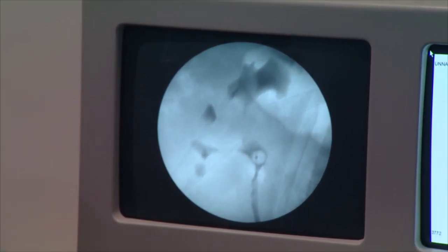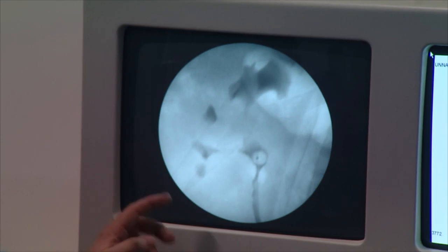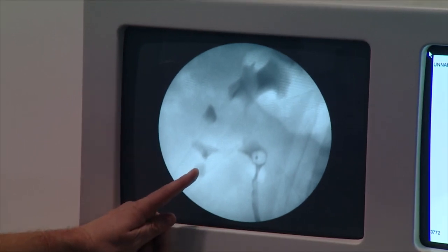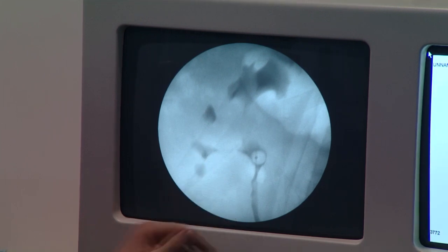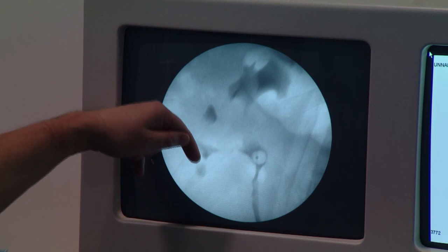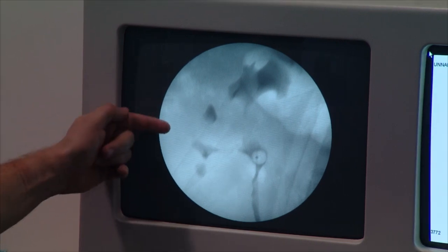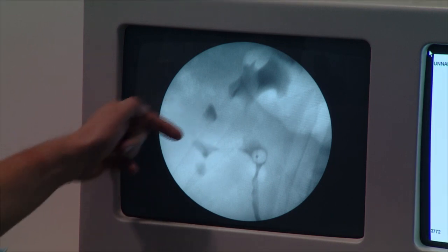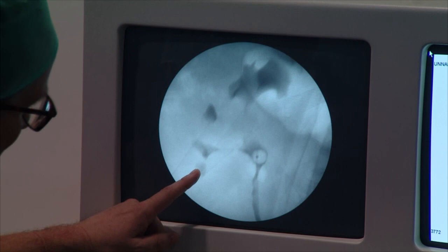You will do the puncture of the other calyx through the septum between the calyces? My suggestion is to do a puncture like this, and to approach the stone this way. But I do not prefer to do a puncture like this and go downwards. That is a puncture which would be done by our Nepalese colleagues. But the German version is going through the lower pole.